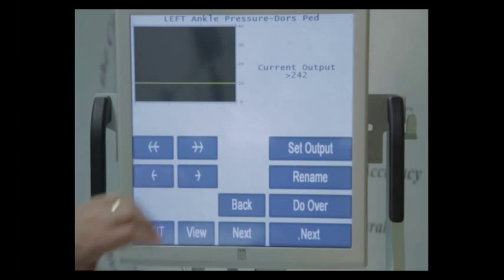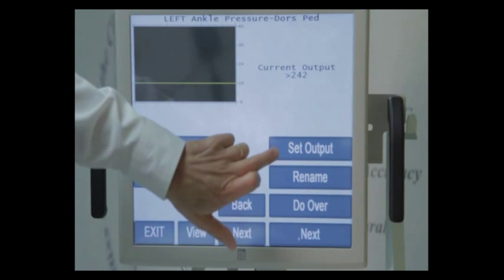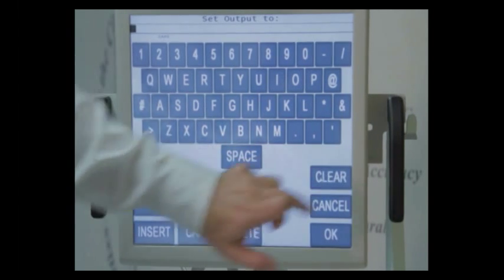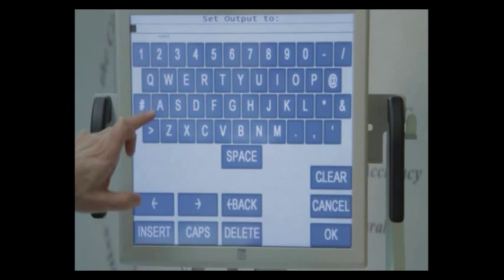Okay, what we're going to do now is we're going to change the set output. Let's say the patient has an amputation. I'm going to press set output, and I'm going to clear the contents, and I'm just going to type in AMP.